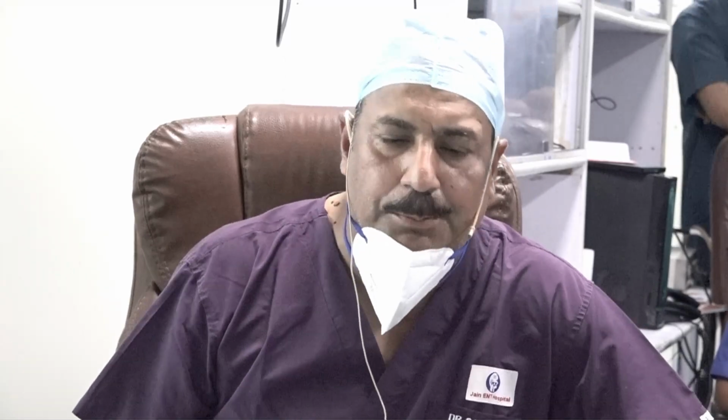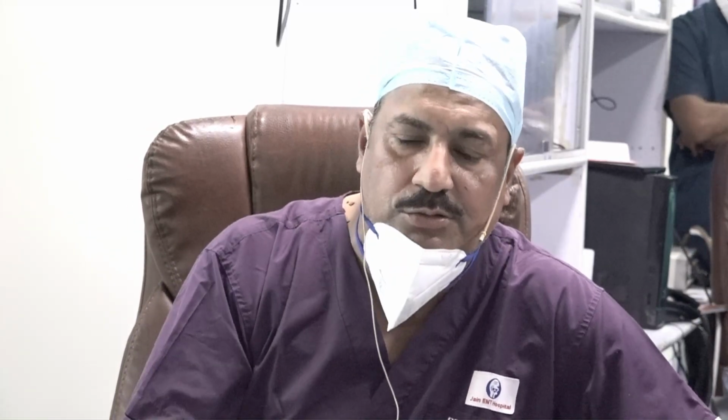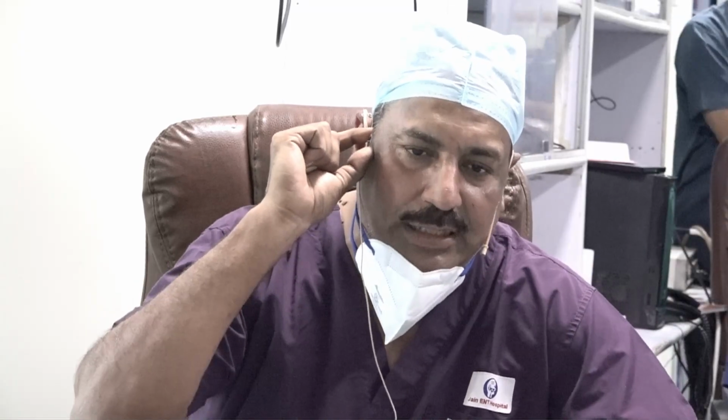And secondly, the simple ventilatory function test, which I suggest to you. Everybody has a tympanometer, and one can easily do that test with the tympanometer. The reason being, the most important function which the eustachian tube serves is ventilatory. As I said just now, every time we swallow, the eustachian tube opens and it drives air through the isthmus of the eustachian tube into the middle ear to equalize the air pressure. So this ventilatory function should be good for the ear to function adequately after the surgery. Otherwise, whatever surgery you have done can go to waste.